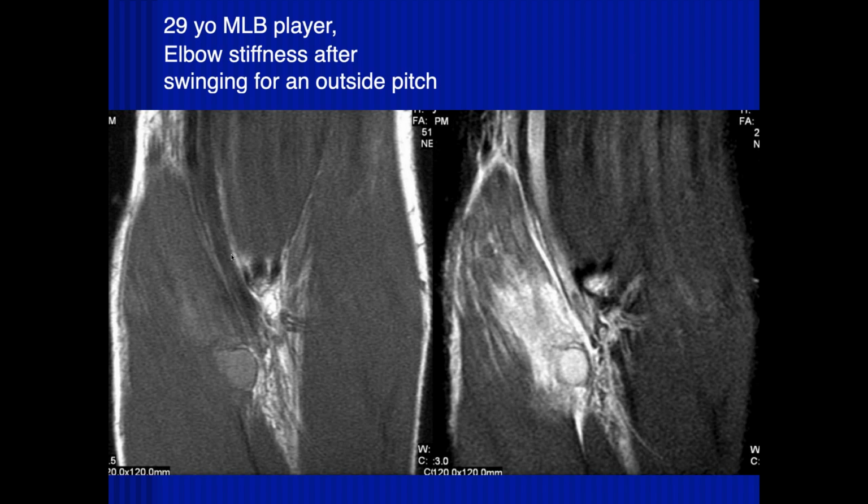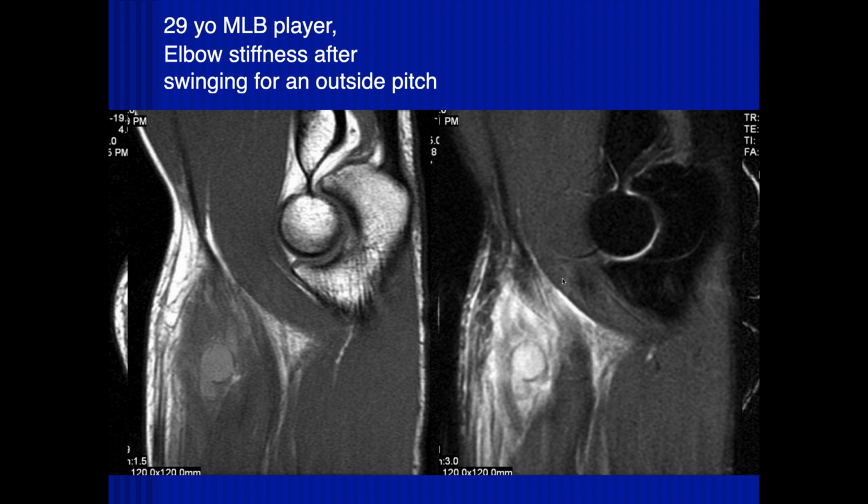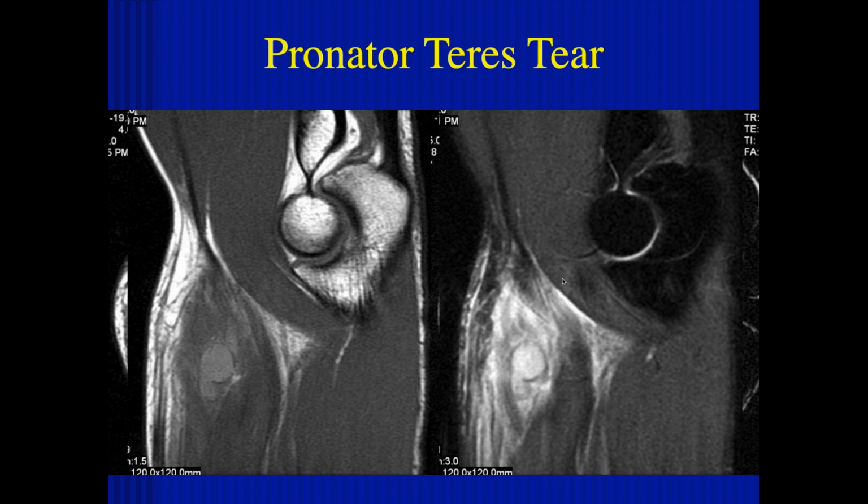All right, so here we have two images of the elbow, and it looks like we're still looking at the pronator teres, and there's some edema and fluid distally. So it looks like there's a partial thickness tear of the muscle, so a grade 2 tear, because you've got a focal hematoma within the muscle. Grade 1 would be streaky signal without focal fluid collection. Grade 2 is with a focal fluid collection. Grade 3 is a complete tear.